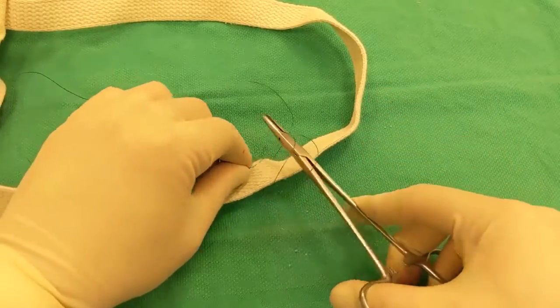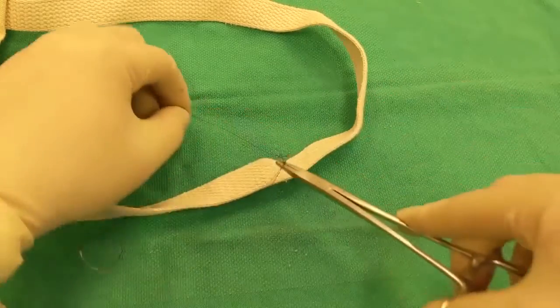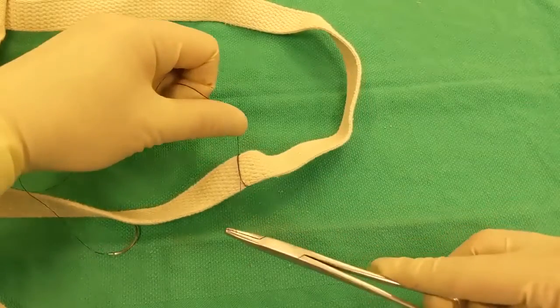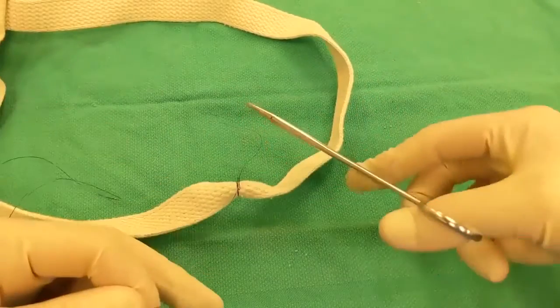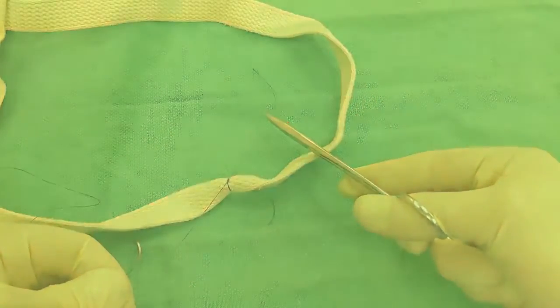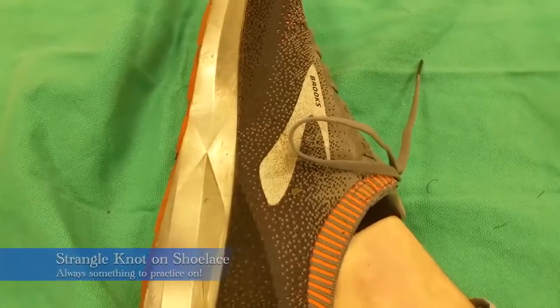So you go through the loop, wrap, and grab that tag, and pull it through. And you can see also, this tissue kind of gives us a little bit of different feedback as well than the stapler did. So it's definitely nice to practice on different things, and there's always something around.